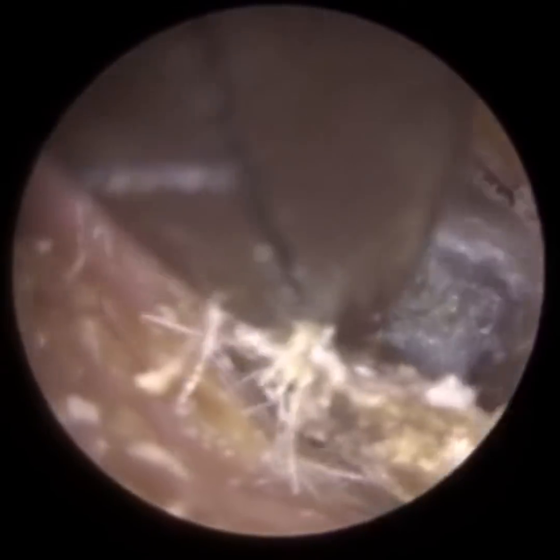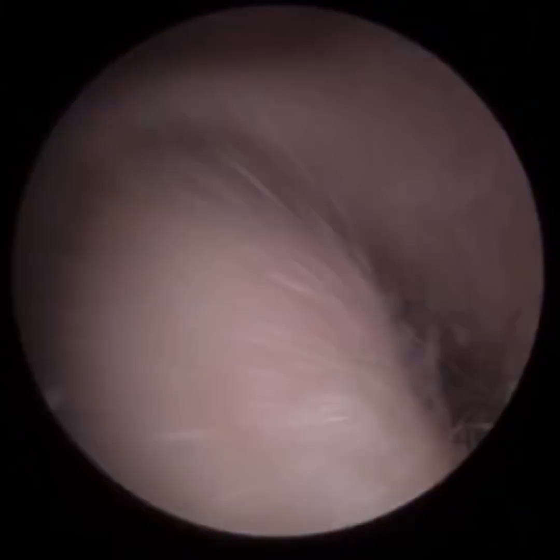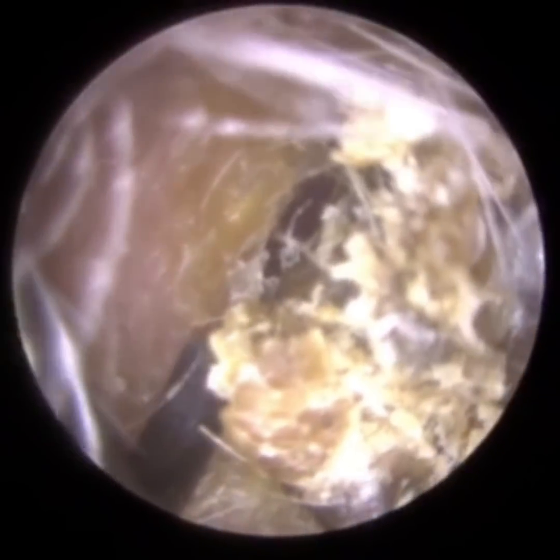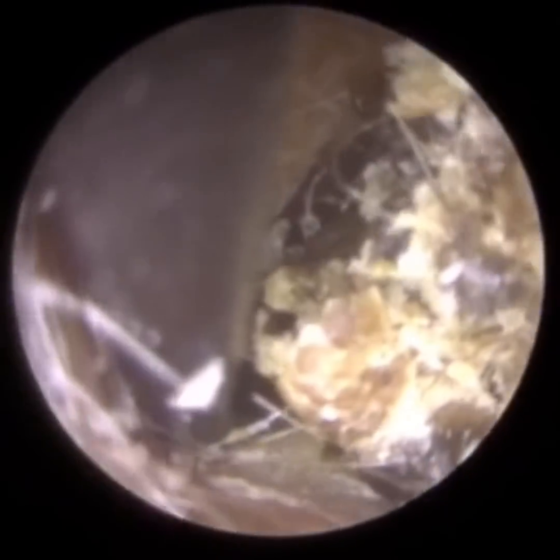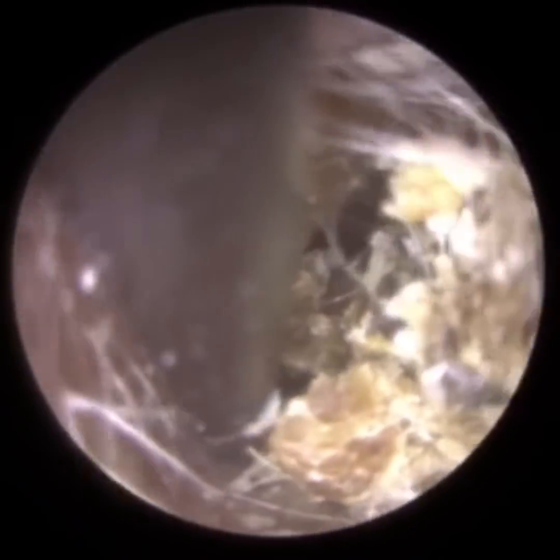It acts like a double-sided sticky tape that's been carried in, and it can make it really, really tricky to extract the wax and detach it from the canal wall. I brought this plug of dry wax and skin out from beyond the isthmus — it was right up against the eardrum. Just using the hook now to bring it out from the ear canal. You can see how dry that is.